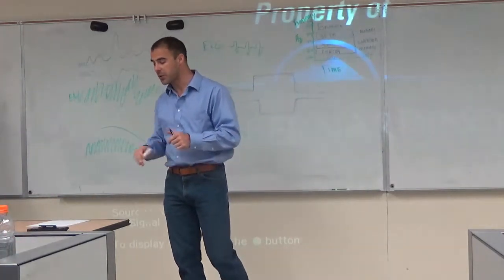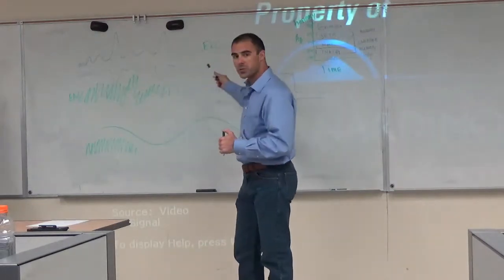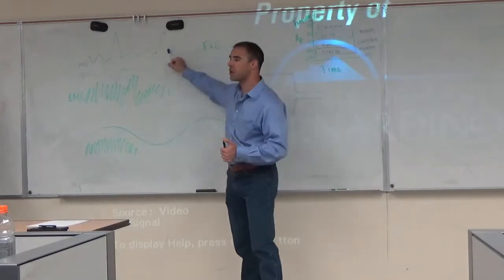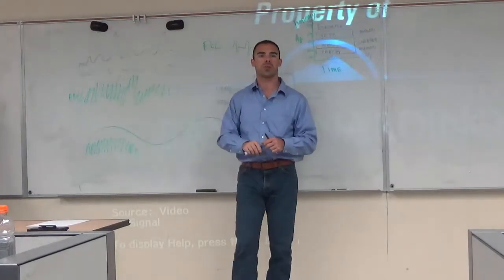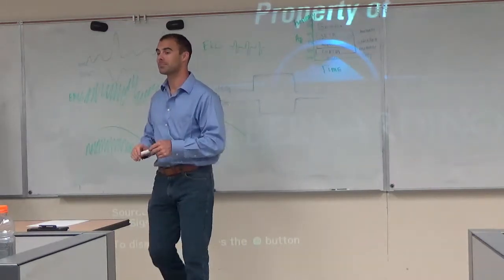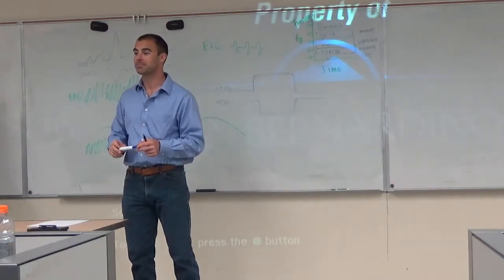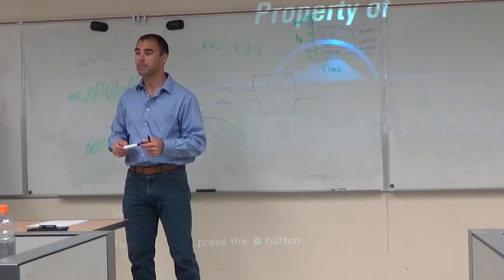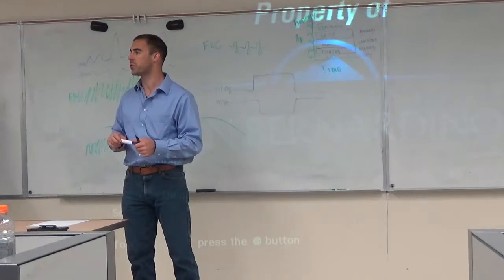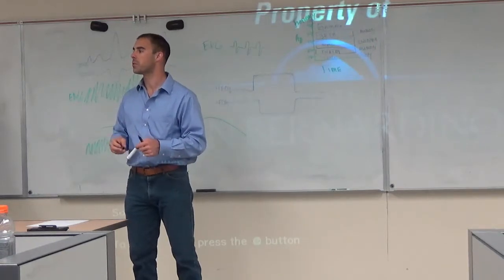Okay, so we talked about some of these now, and other parts of the question were ways to deal with these things. So if you see blinks in the data, what's one thing you can do to either prevent it or to cure it once you see it? Yes, Kelsey? Tell your participant not to blink when they're looking at the word. Yep. And is that also part of why you can give them a little focus cross? Because it gives you someone to look at, but also like, hey, you can blink now. Yes. Okay, Ryan, what's a way that you can deal with it if they happen to blink?